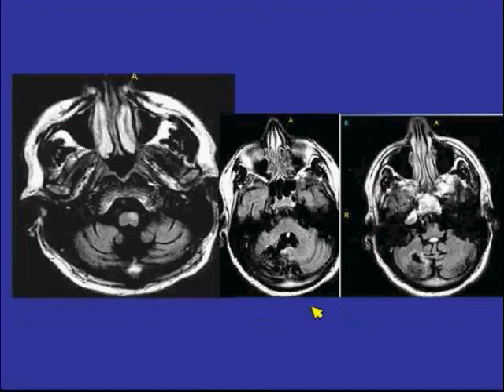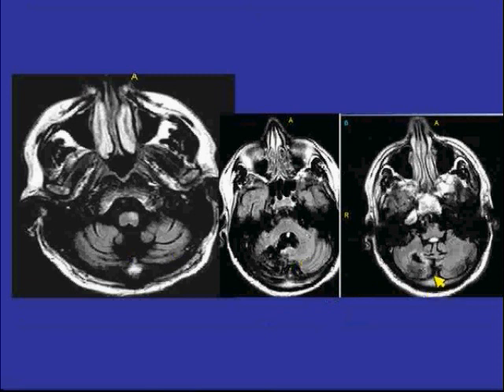The FLAIR scans are demonstrated here, from the level of the medulla, extending to the middle cerebellar peduncle, and then another shot down towards the dentate nucleus region. These are the axial FLAIR scans.